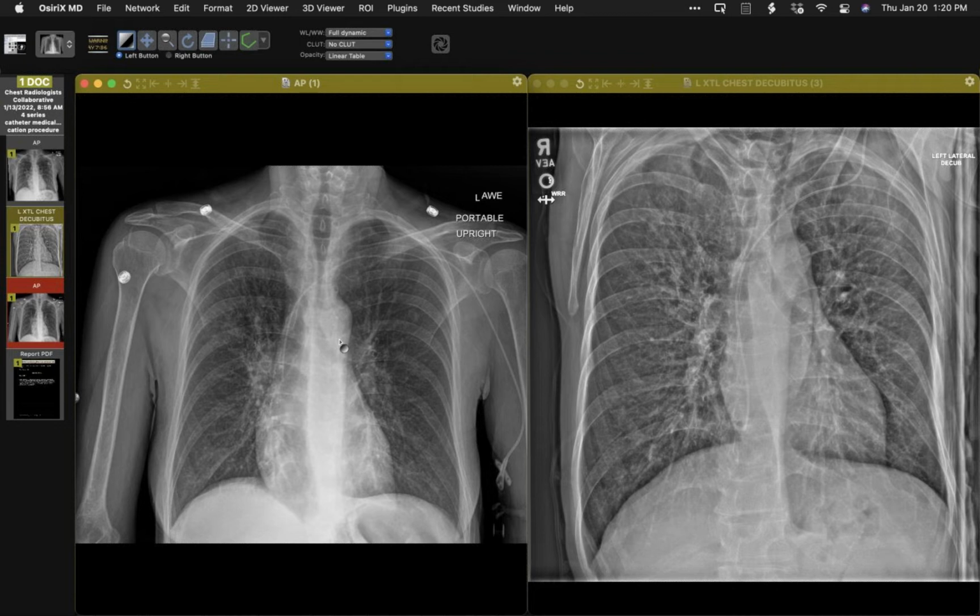What I also find interesting is they typically park hemodialysis catheters in the right atrium, but that doesn't seem to cause PVCs. And what I was told by, I think, one of the interventional radiologists years ago, is that because the dialysis catheters are much stiffer, they tend to just stay intraluminal, not float around, whereas the PICC at body temperature is pretty floppy. And so as the heart's beating, it can flop around and so-called tickle the atrial wall, whereas the dialysis catheters tend to stay put.